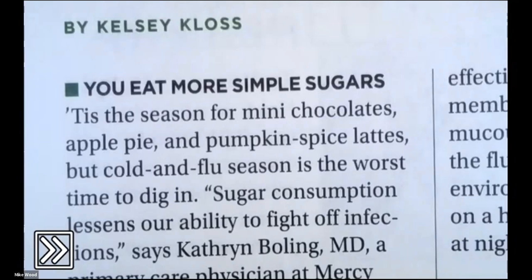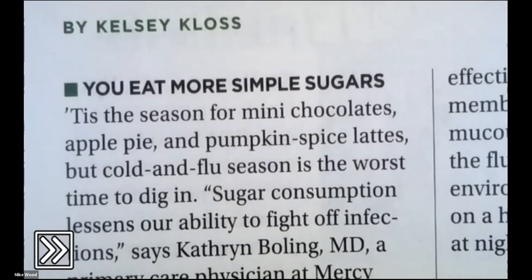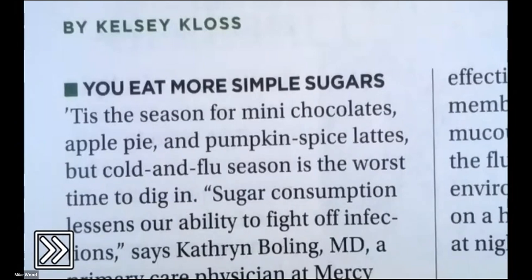One person says they're having issues with battery length. What can you do to keep the battery lasting longer? One key thing: there's often confusion about whether the unit is totally powered down. If I press the top left power button quickly, the Juno goes to sleep — it instantly comes back on when you press it again. That's just sleep mode — the unit is still running and using a minimal amount of battery. To completely power off, press and hold that power button until you hear the melody it plays, which means it's powering off totally. That saves the most battery life.